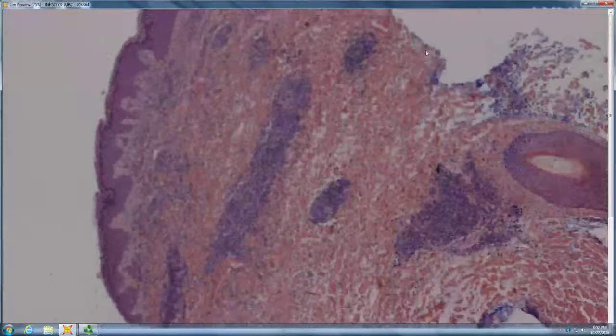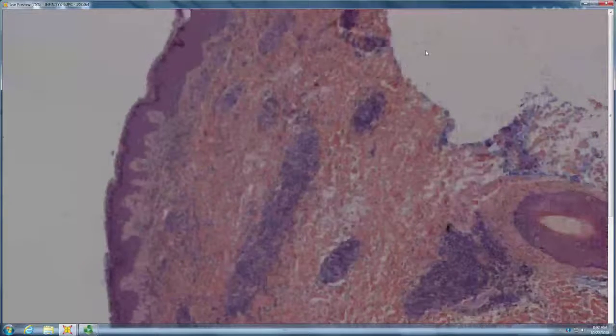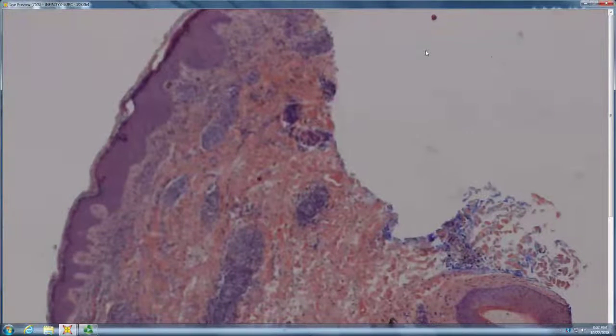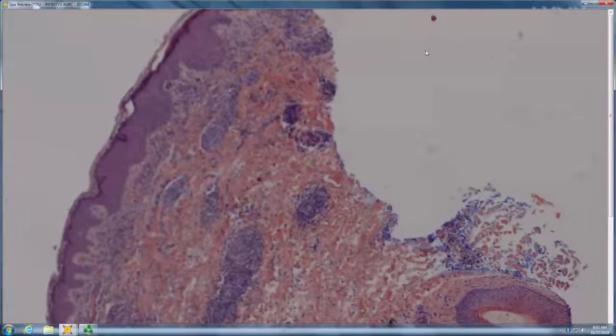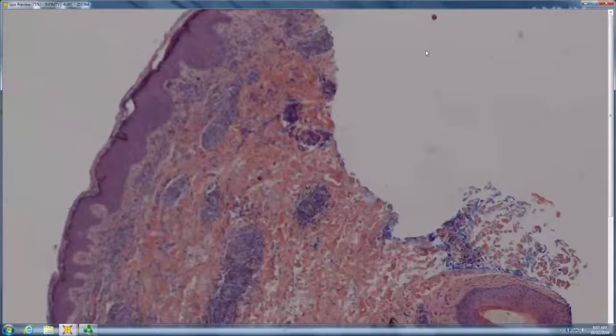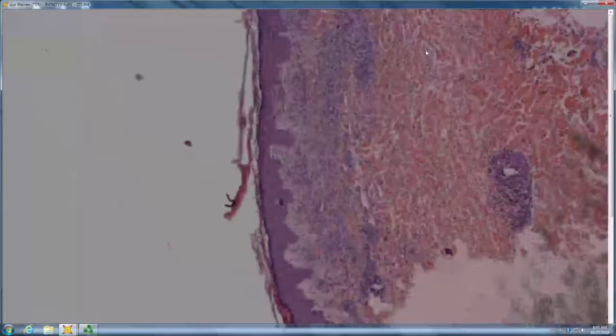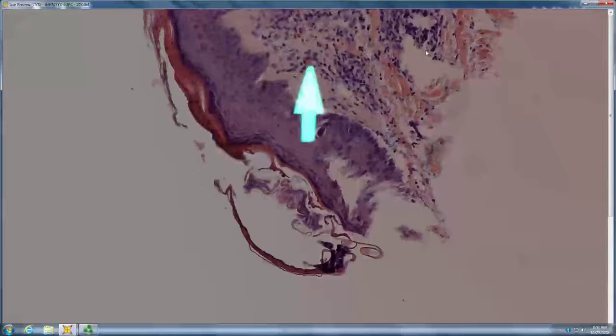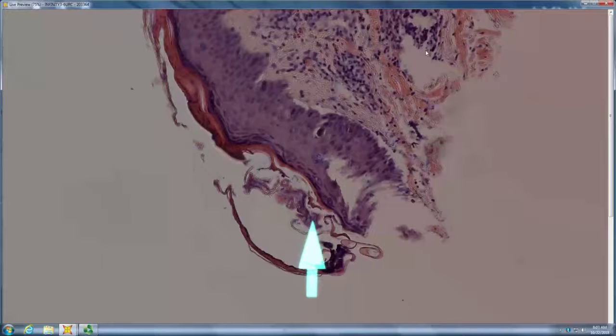Anyone want to jump in? Yeah, so I heard both bite and arthropod. Which one do we tend to say in sign out? We write arthropod. We don't say bite, but we know it could be a stick, right? It could be a sting, but what else could it be? It could also be an infestation. This is a patient with scabies. Right, so arthropod reaction can be bite, sting, or infestation, which is why we're always careful to say arthropod reaction in sign out.